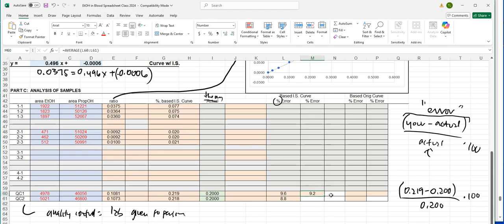Then what you'll see here to the side is a random standalone number under the percent error column. This is just an average. In an updated template, I will give you the average so that I can mark it appropriately. It is just the average of these two values. If I click that cell, it looks like equals average. Then I just click and drag down, highlight these two numbers and hit enter, so that it will perform that calculation for me.